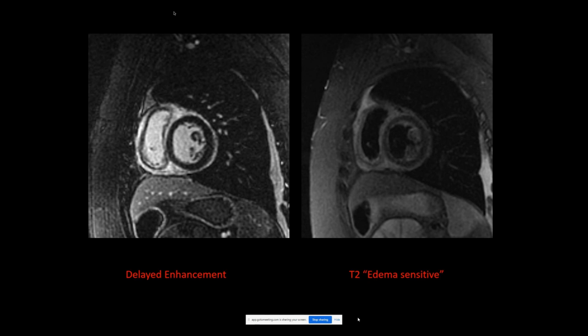And so anyway, eventually, after collecting another 10 more years of cases, we have gone back and done another analysis that we're trying to get through the literature. Had a little trouble in peer review, but essentially, they looked at correlation with biopsy. And again, there's very poor correlation with any sort of rejection or myocarditis. But what is clear is that when patients have this pattern and they have a reduced EF, they all invariably have a reduced EF, usually 40% or 30% range. And when they give them immunosuppressives, it gets better. So we think this is actually probably a better marker of rejection than biopsy.